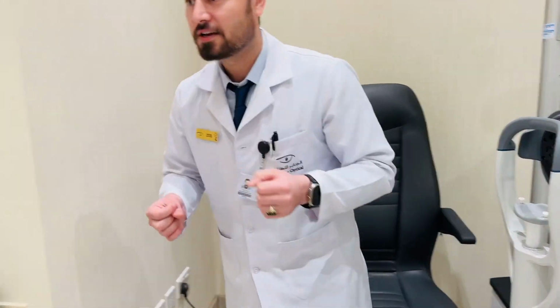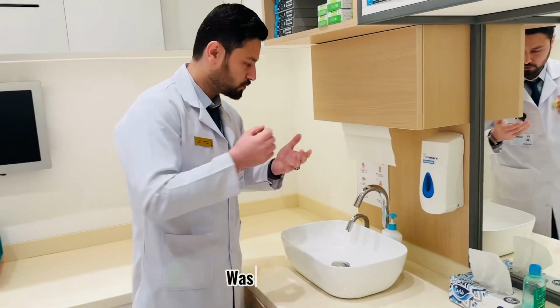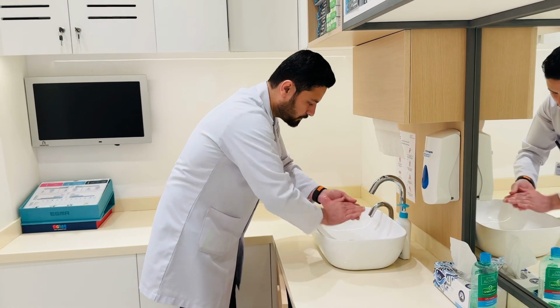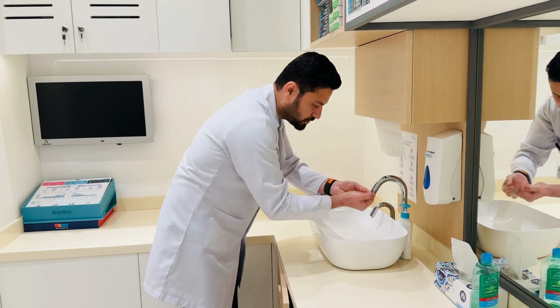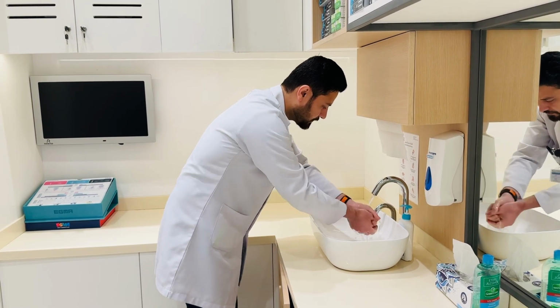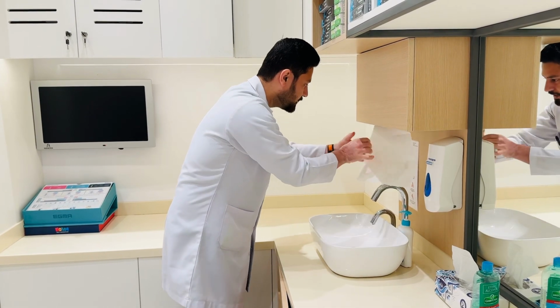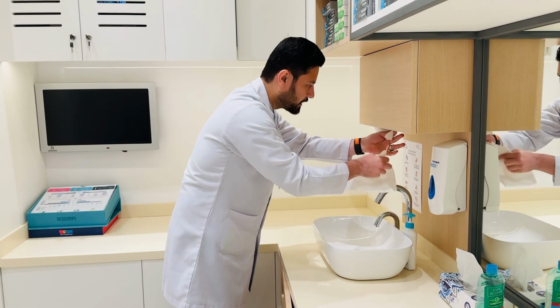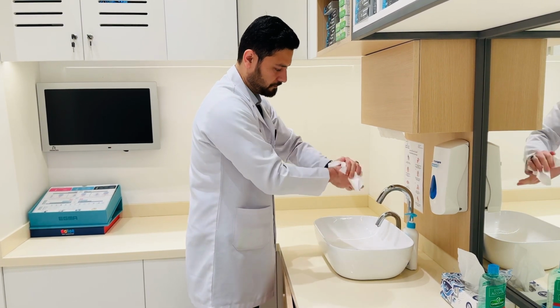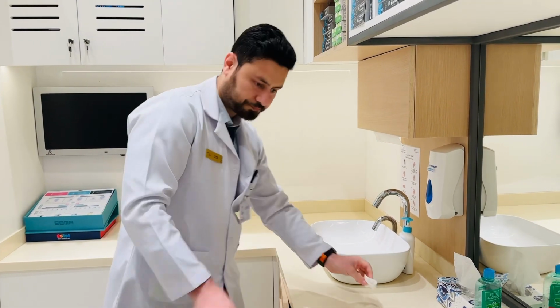So first thing, you will wash your hands. It's a must, not with dirty hands. So first you will wash your hands with soap, like this. Your nails, everything should be clean. After washing the hands, make it completely dry. You make it fully dry.